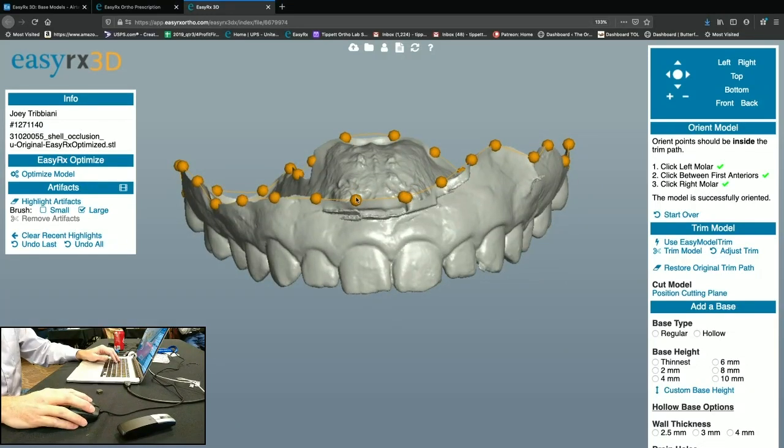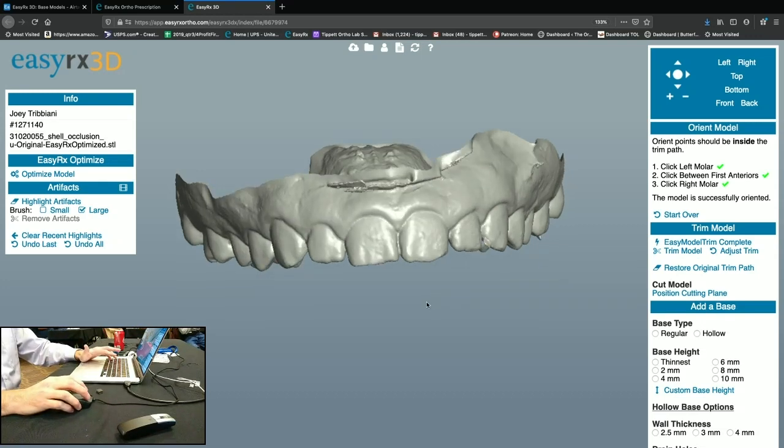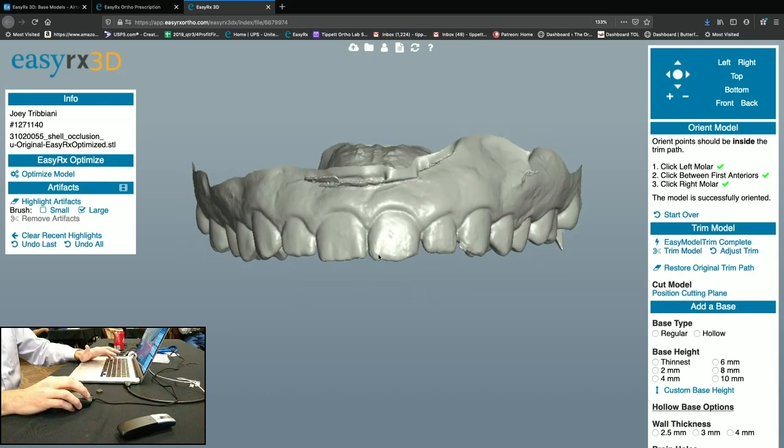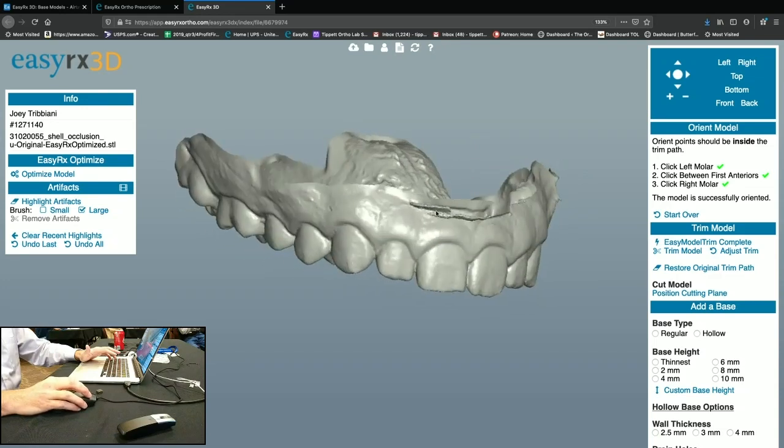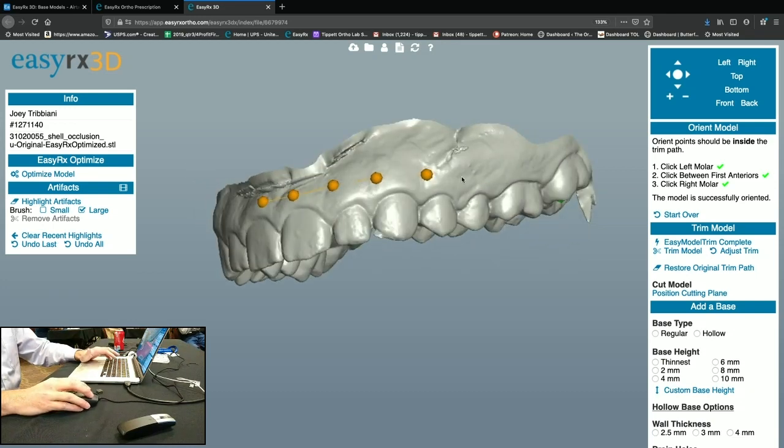So these are trim dots. You can move them down to the trim you want, but it could take forever. So you just use easy trim model. I don't know if Sarah can see my keyboard or not, but I'm holding down the shift button right now. So if I try to drag my mouse across here, it's going to try to move it. So if I hold shift, it's going to hold the model in place, and I can drag my edit line.